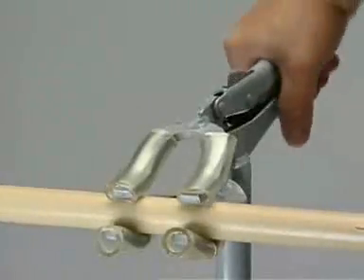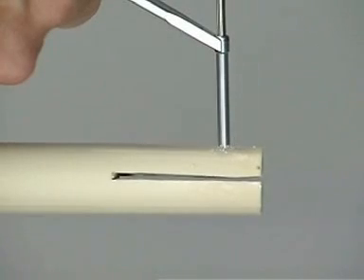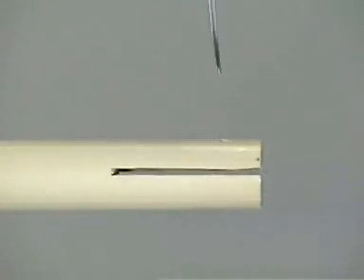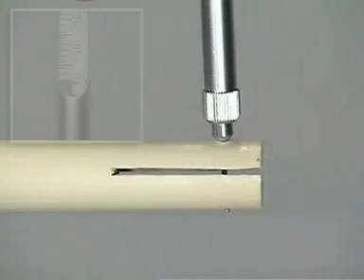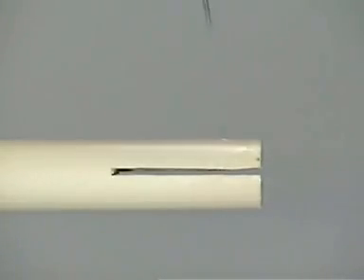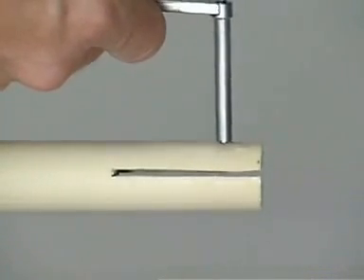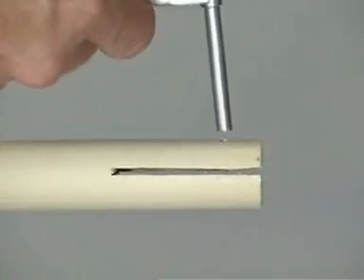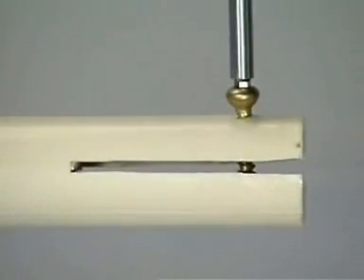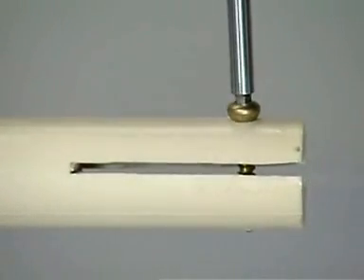The generic bone is fixed in the bone clamp. Using the 3.2 millimeter drill bit and the 3.2 drill sleeve, both cortices are drilled through perpendicular to the fracture plane. The depth gauge is used to determine the required screw length. The thread is cut using the 4.5 millimeter tap. The 4.5 millimeter cortex screw is inserted. Compression between the screw head and the bone surface is obtained, but as both the near and far cortex are threaded, the fracture gap will not be closed or compressed. This screw is called a position screw.